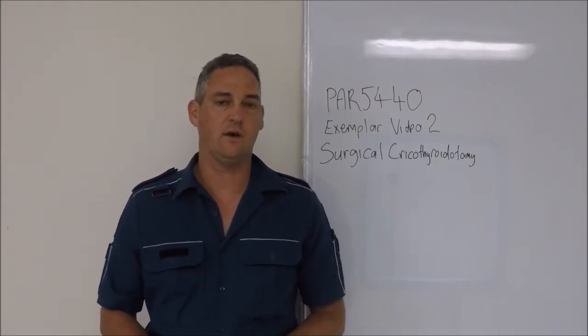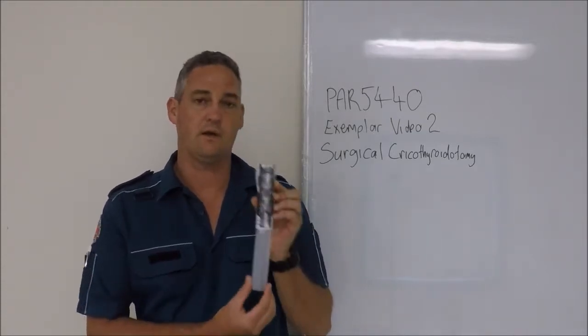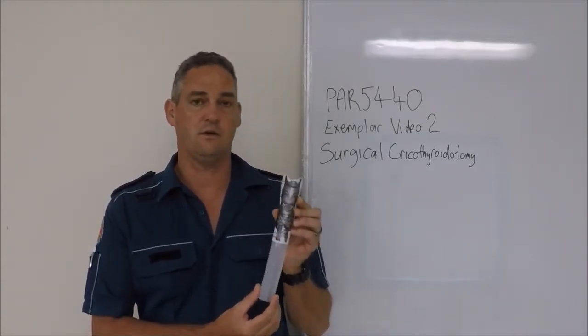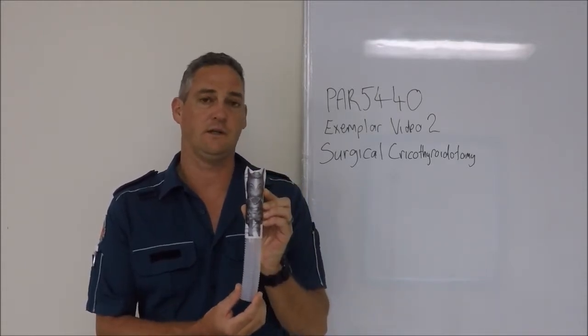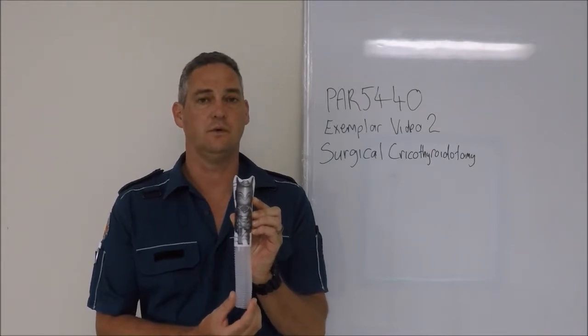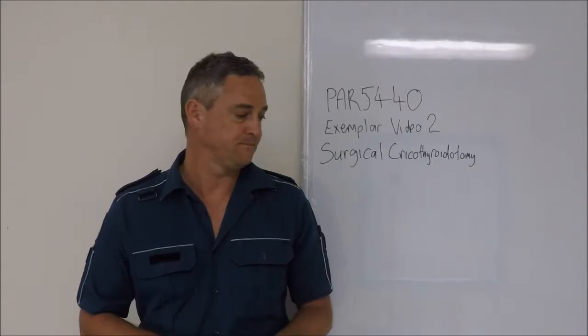Unfortunately, I don't have an airway mannequin that I can do a surgical cricothyroidotomy on. So I've had to make up my own using some ventilation hose and a bit of an airway, which I'll use to actually demonstrate the procedure of a surgical scalpel finger bougie cricothyroidotomy.